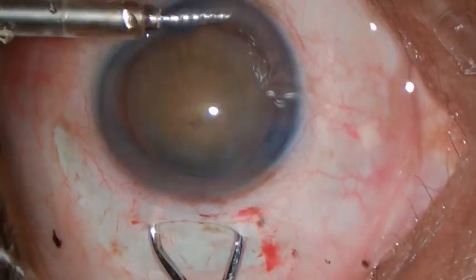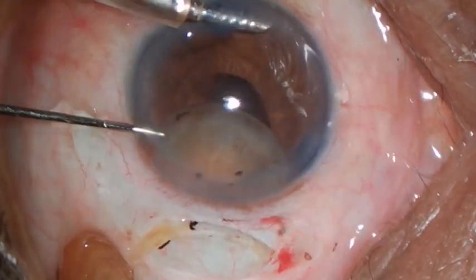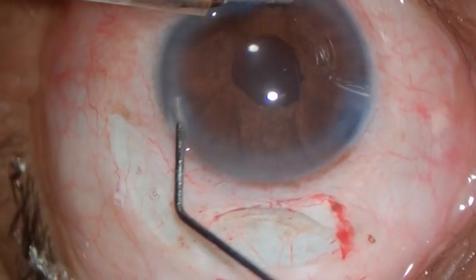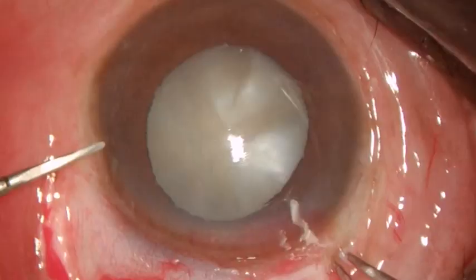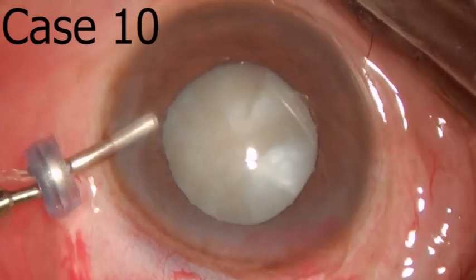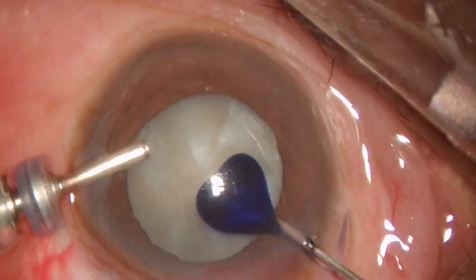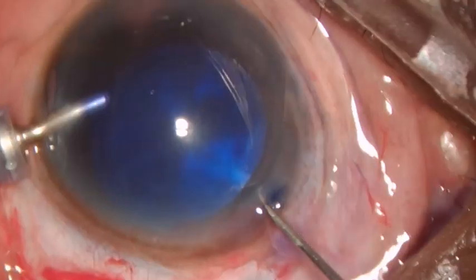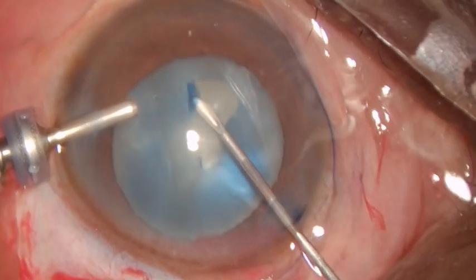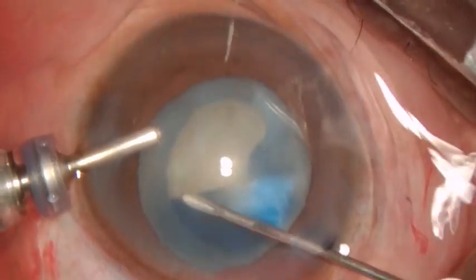In this small series of surgeries, we would like to give a message that surgery can be safely performed without visco. In the ninth case, the nucleus was large, it was engaged in the wound and later delivered by making two pieces. In the ninth case, we used a 23 gauge infusion cannula instead of an AC maintainer, which is freely available with the vitreoretinal surgeon. We could not find any added advantage over the AC maintainer.